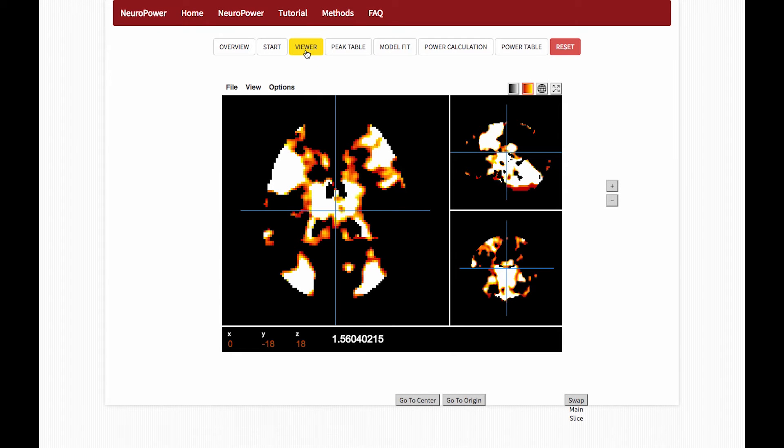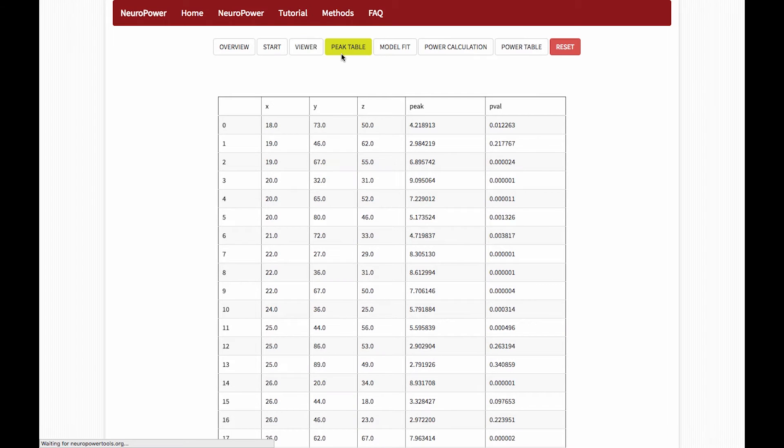Next, we're going to look at the viewer. This will show you, if you pulled your data from NeuroVault, the group level Z map or T map. The peak table is simply the coordinates of each peak Z value, or T value, as you may have it.